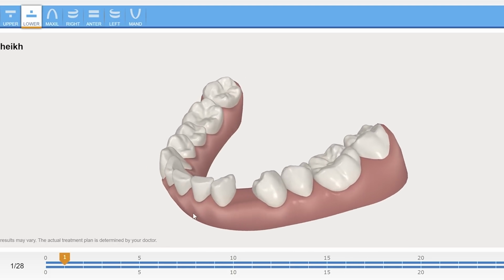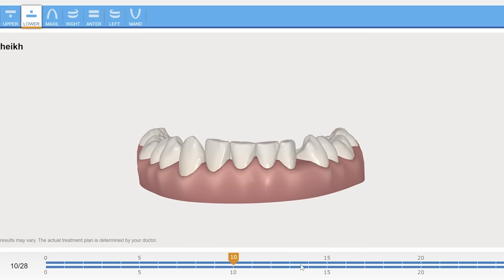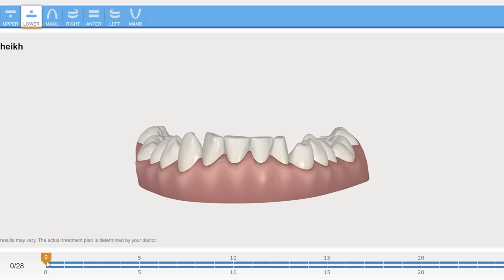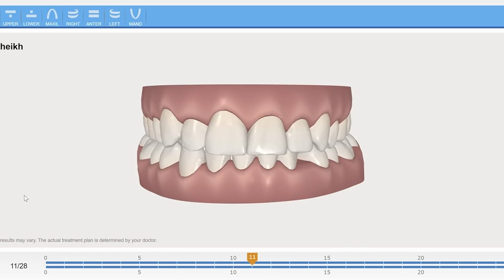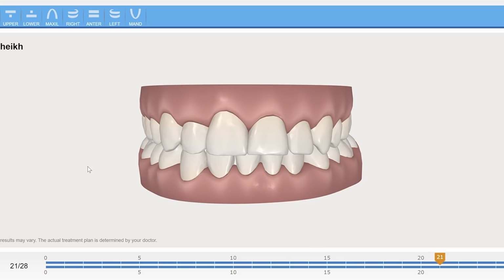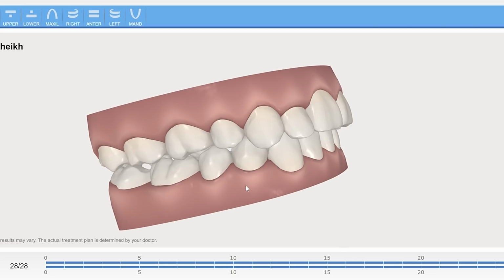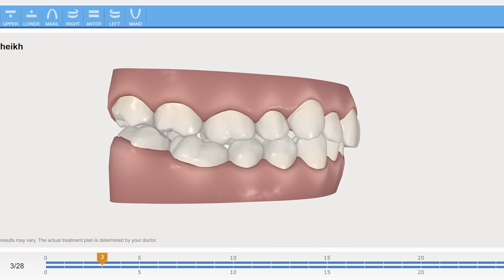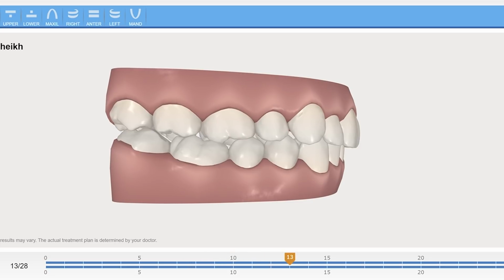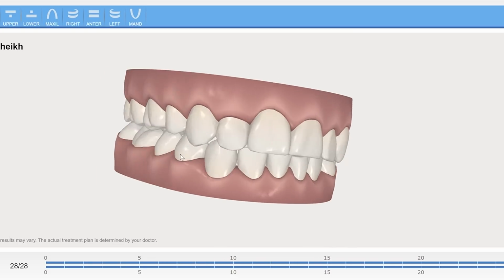But anyway, this simulation is going to basically run over the 28 weeks. You can view what your teeth look like on a certain week, so a certain tray, and it shows you what's going to happen to your teeth. The only limitation with this software, I know, is it doesn't account for any additional wear of the teeth, which I don't think there will be because Invisalign stops that. And it doesn't account for the change in wear or the change in shape of your gums when your teeth move. Everyone will know this in life. If you've had a new tooth come in, the gum will eventually wear and your teeth will straighten and everything else with just general eating, general wear. So it doesn't simulate that. So the final result is good, but it's not perfect.